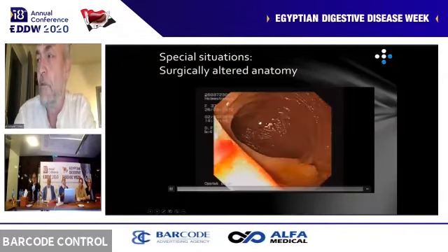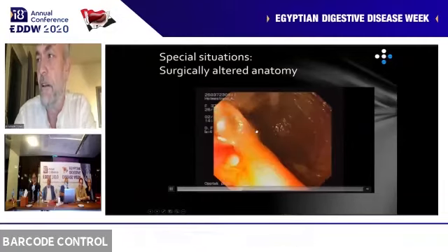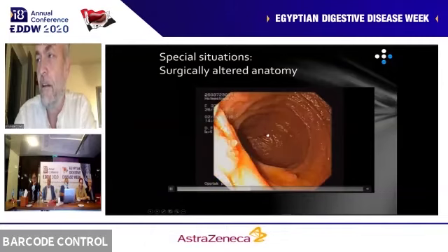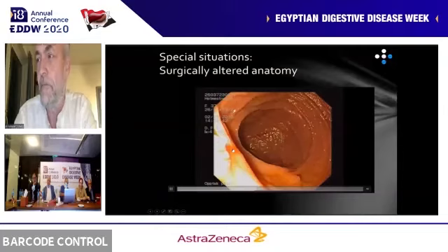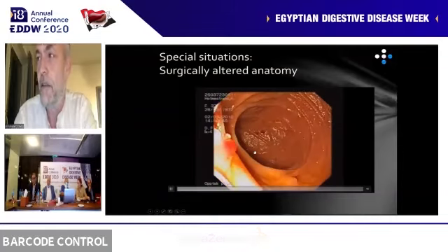And what you usually then do is to try to slide over it with your catheter and try to find the orifice. And I think these days we usually use a cap on the scope, because that flips down the ampulla.